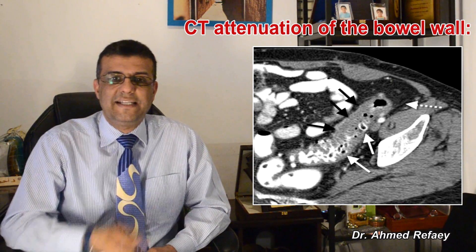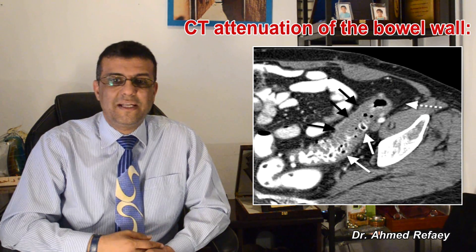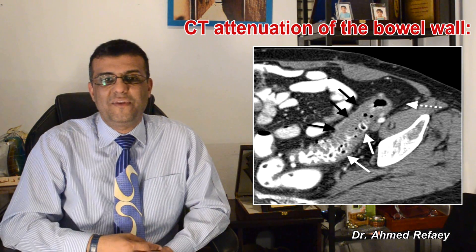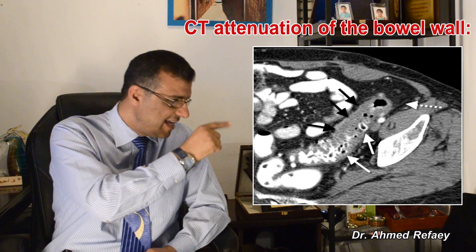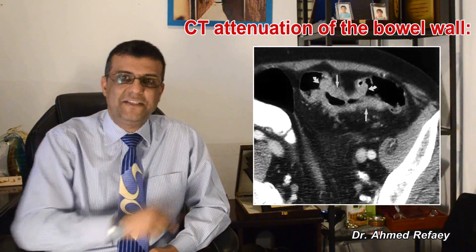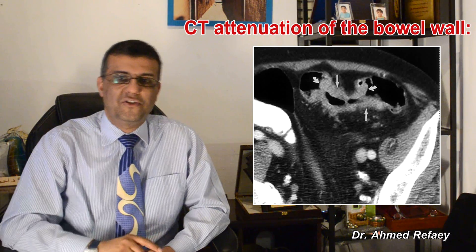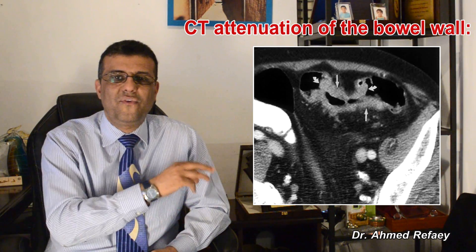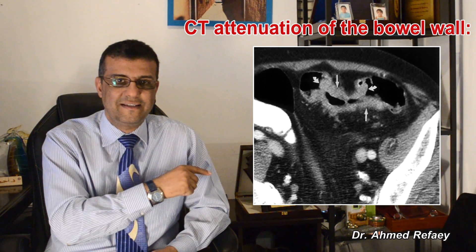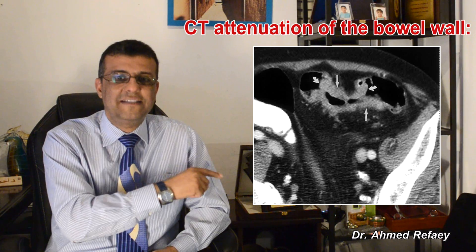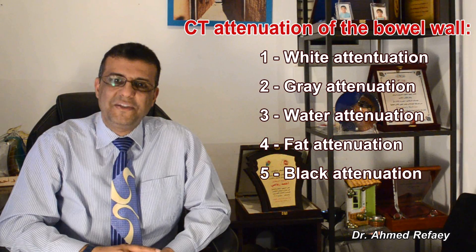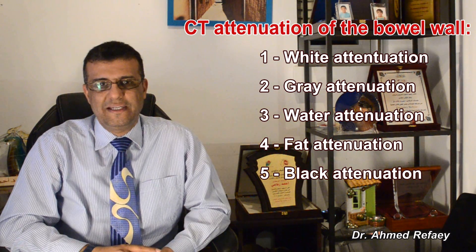This is a case of diverticulitis. There are multiple diverticula in the sigmoid colon associated with marked thickening of the wall with a degree of enhancement similar to the adjacent muscle. Another example of gray attenuation is a case of sigmoid carcinoma, showing an annular mass lesion involving the sigmoid causing shouldering of the wall, with enhancement similar to the adjacent muscle.